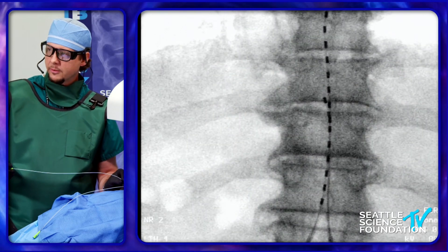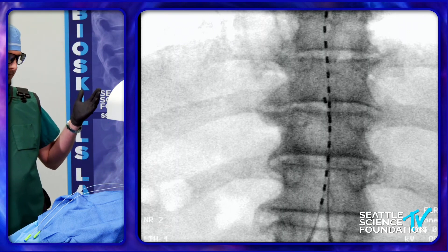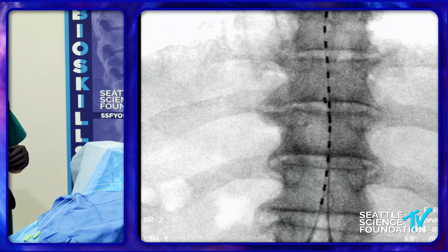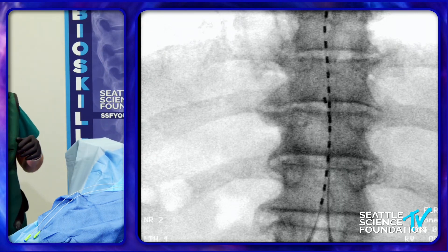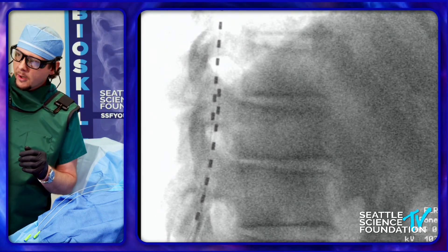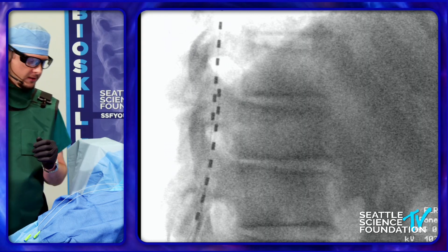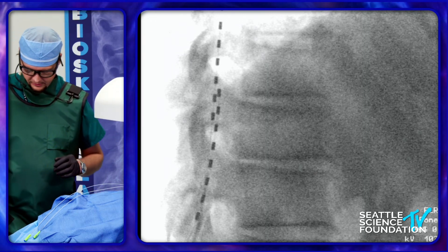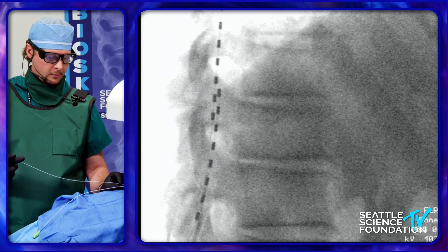I'm going to double check with a contralateral oblique or a quick lateral — that's been helpful for me and doesn't take much extra time. Especially coming out of training, if you have a hard time appreciating a contralateral view, this is a good clear way to confirm. You can see we're pretty much back there and still in the dorsal space. Appreciate that we're still midline there.